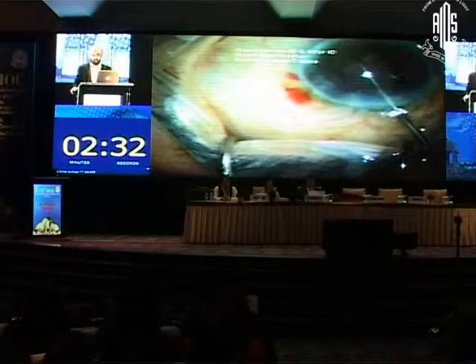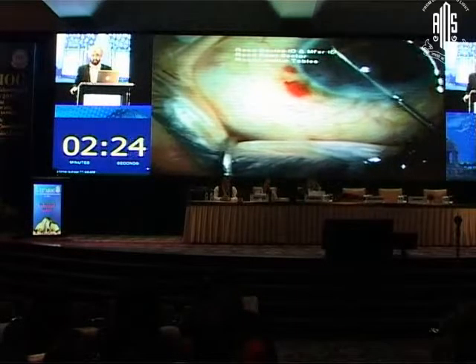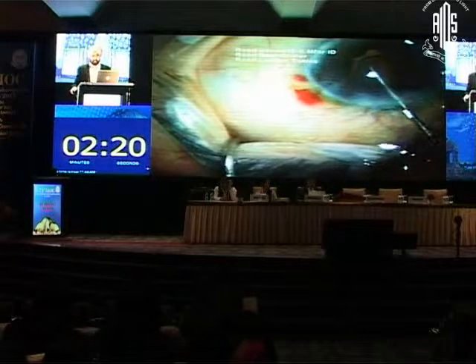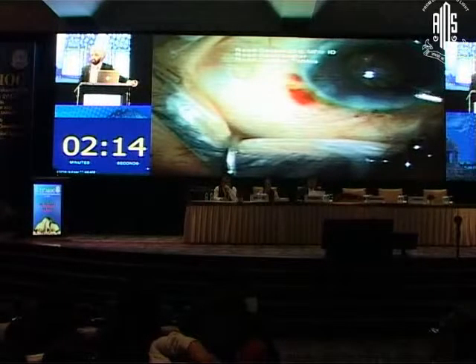A surgeon had it all going well, putting in the ring, doing the phacoemulsification, and getting things done, but putting in a lens, I showed you a nanophthalmic eye with a 57 diopter lens, which was a problem. Now in this particular case, a normal thing, and this also caused a problem. So this is what I wanted to show.